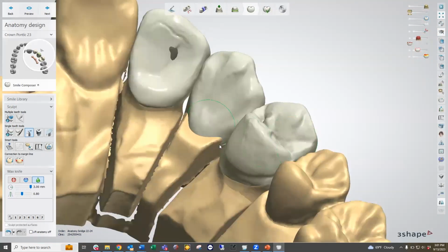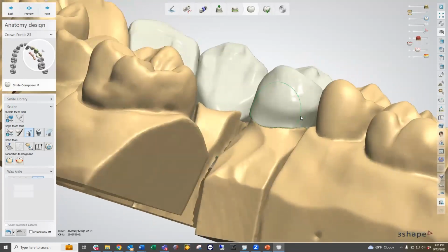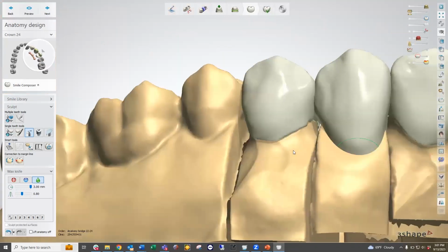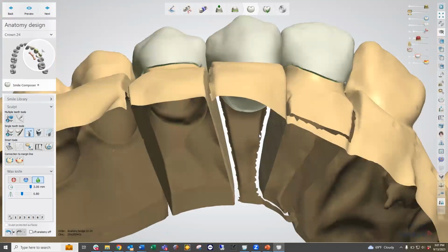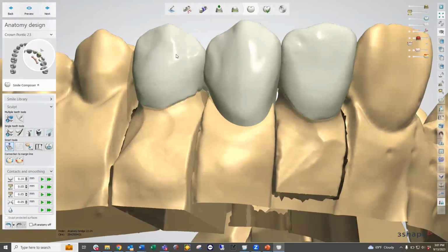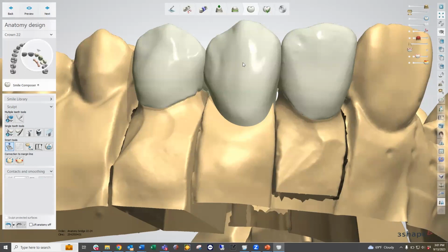With no option to connect it to a margin line, because it has no margin line, the pontic needs to be cut to the individual model that we have scanned in. To do that, we have to use our smart tools, and we have to be selected on the unit. We select between the individual units by clicking on it once, and you'll see the change appear over here in our map. This map indicates with the green or gray arrow what unit we're currently selected on. I can select the pontic, or I can physically select it up over here as well, to ensure that I'm selected on the pontic.